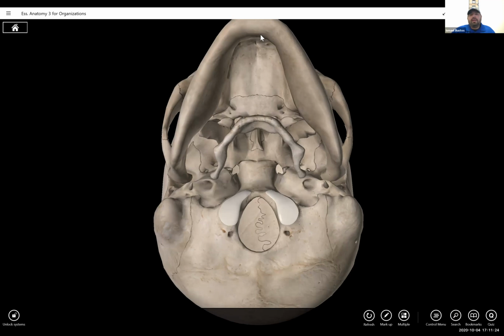So again, either you're not extended enough to do an SMV, and this guy is having technical difficulties here. Give me 1 second. All right. Either you're not extended enough, so you were kind of like this, or your CR was not perpendicular to the IOML.